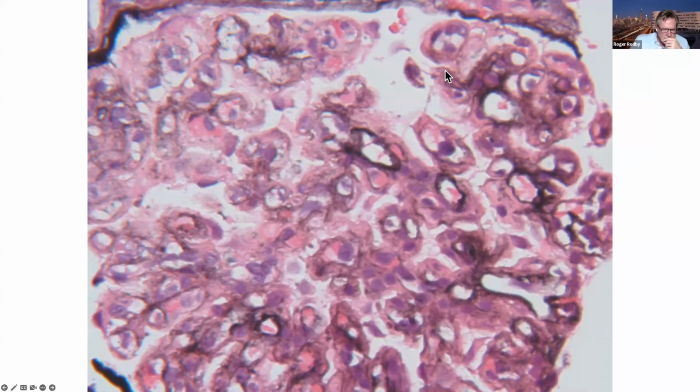Those look like nuclei in there, David? Interposition? It looks like there's 3 nuclei there on the periphery of that loop. Overall, they have complexity to them. It looks like there's some remodeling over around 10 o'clock, and down to the right a little bit.